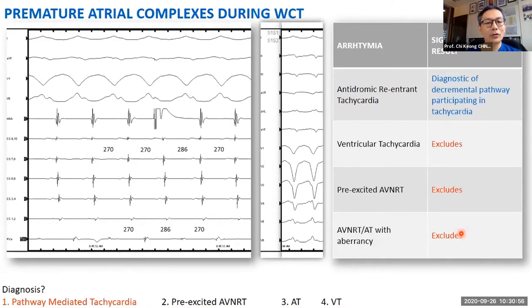I think Paul, you show a very nice case where it actually post-excites. More commonly it pre-excites, but post-excitation rules in the presence and participation of that decremental pathway. I think that's a very good learning point. Over to you, Paul.